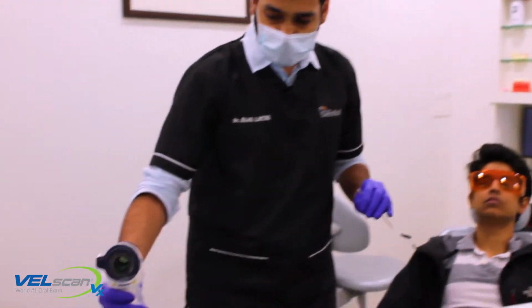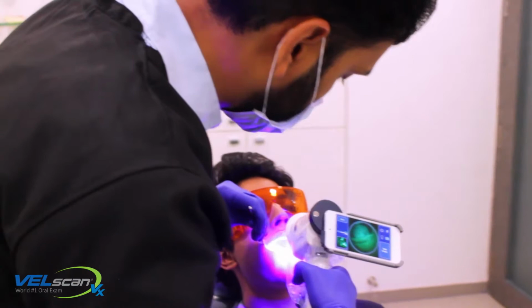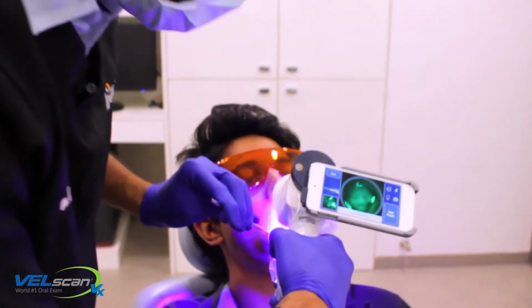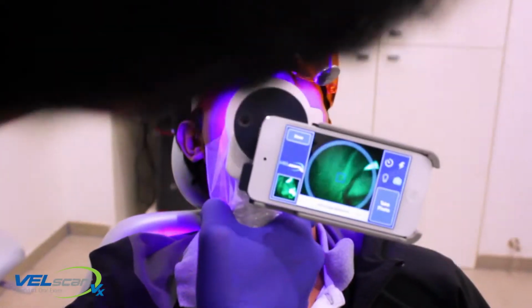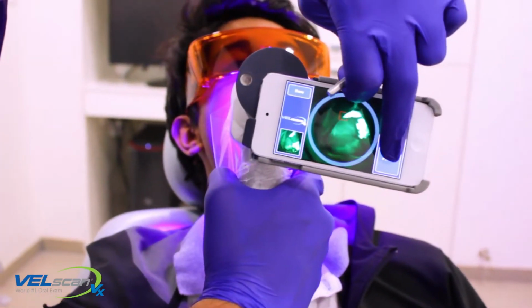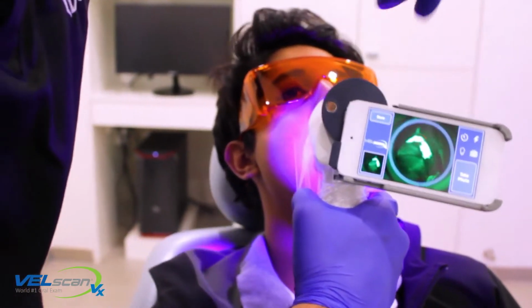What happens next? So we are going to scan all the soft tissues, the buccal mucosa bilaterally, the floor of mouth, the tongue, the labial mucosa, the hard palate and the soft palate. If at any point we feel that there is loss of fluorescence, we can actually capture it and store it for our further reference.